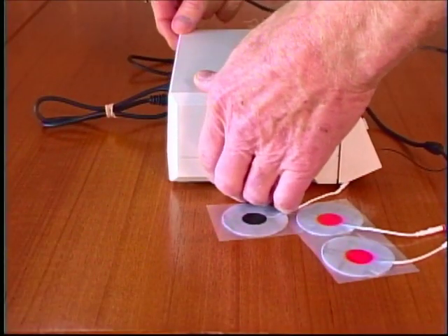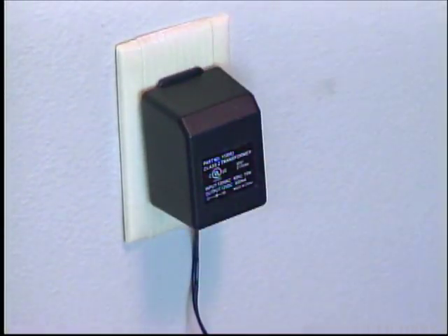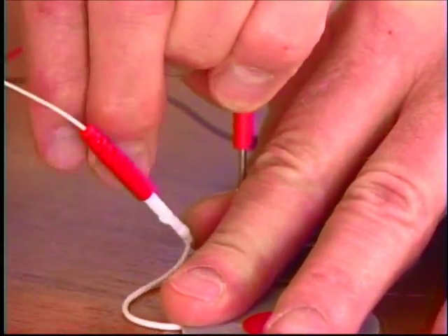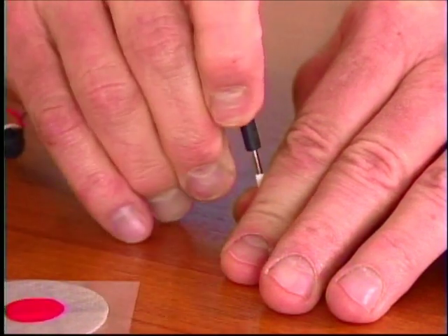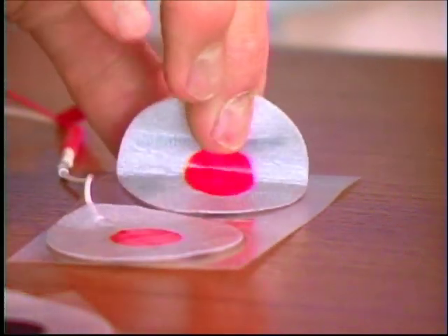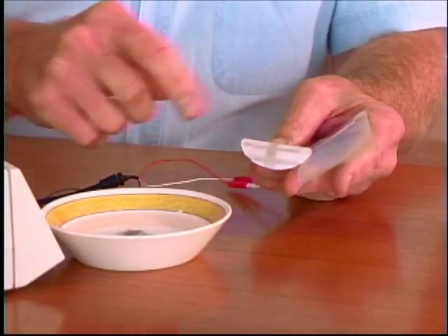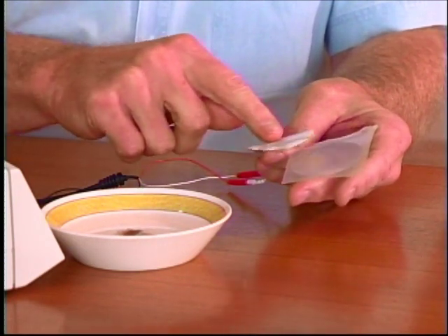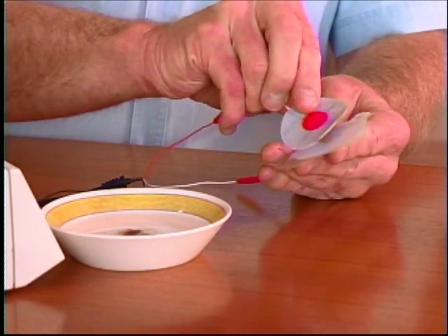The NeuroMove has a built-in rechargeable battery. We recommend you recharge it every two to three weeks. Connect the two red sensors to the red connectors and the black sensor to the black connector. Remove the plastic pads from each sensor, making sure to grasp the sensors by their collars. These are reusable sensors, and you can extend their life by adding a drop of water to the adhesive surface immediately after each use, then replace them on their plastic pads.